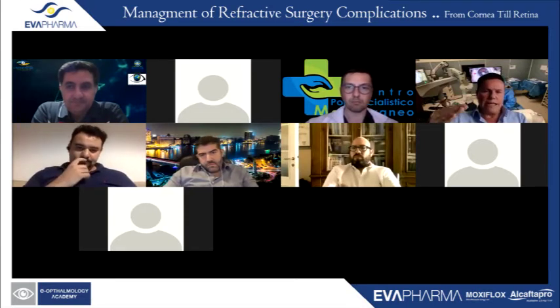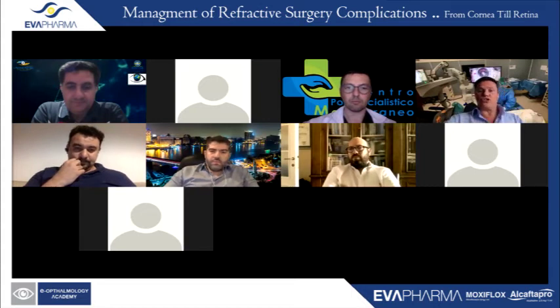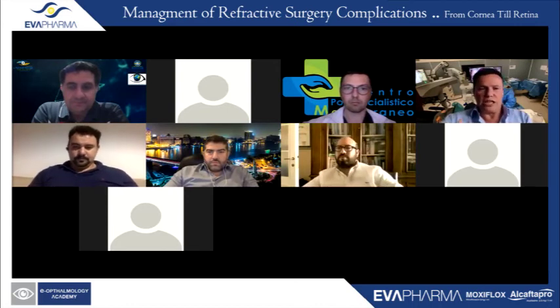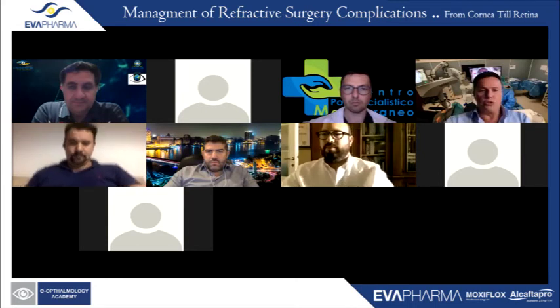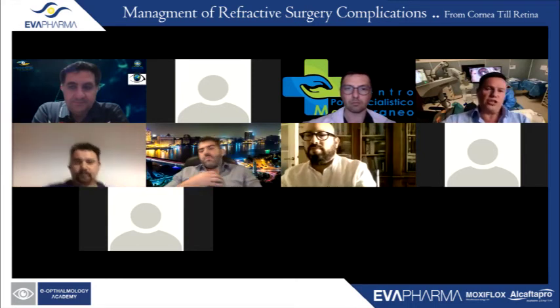You will be good for many years, but bear in mind, maybe in 10, 15 years, you will end up with a +1 or +1.5 diopter, but you can still exchange the hyperopic ICL with another power, because this is the beauty of the ICL. It's reversible, or when they're old enough, you can do a refractive lens exchange as well.